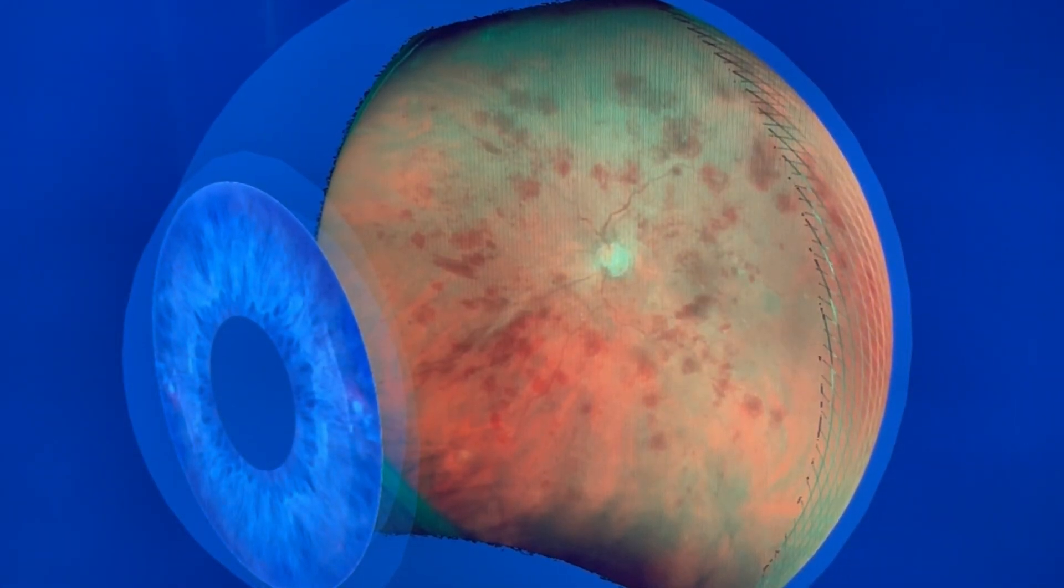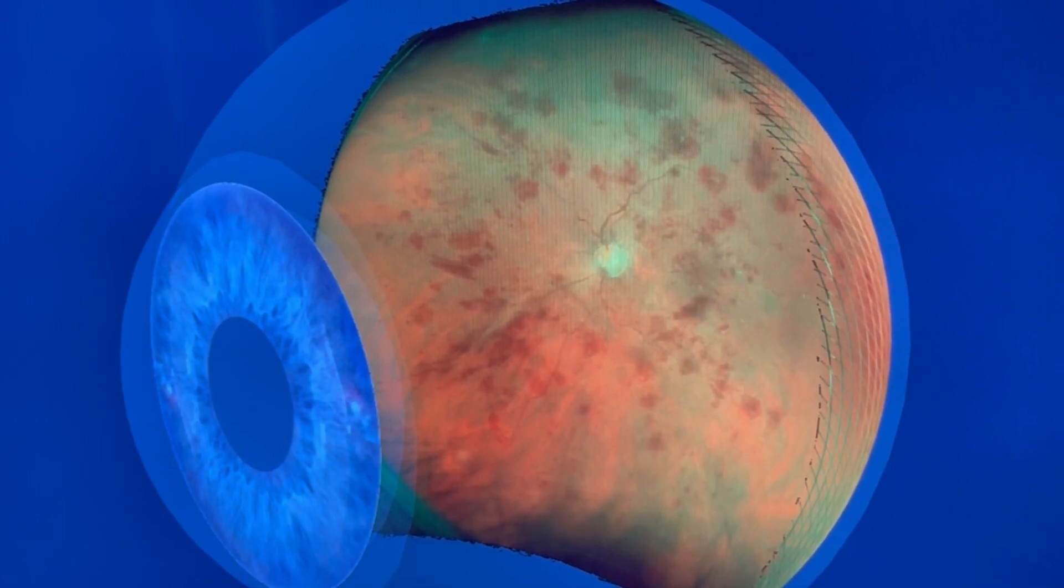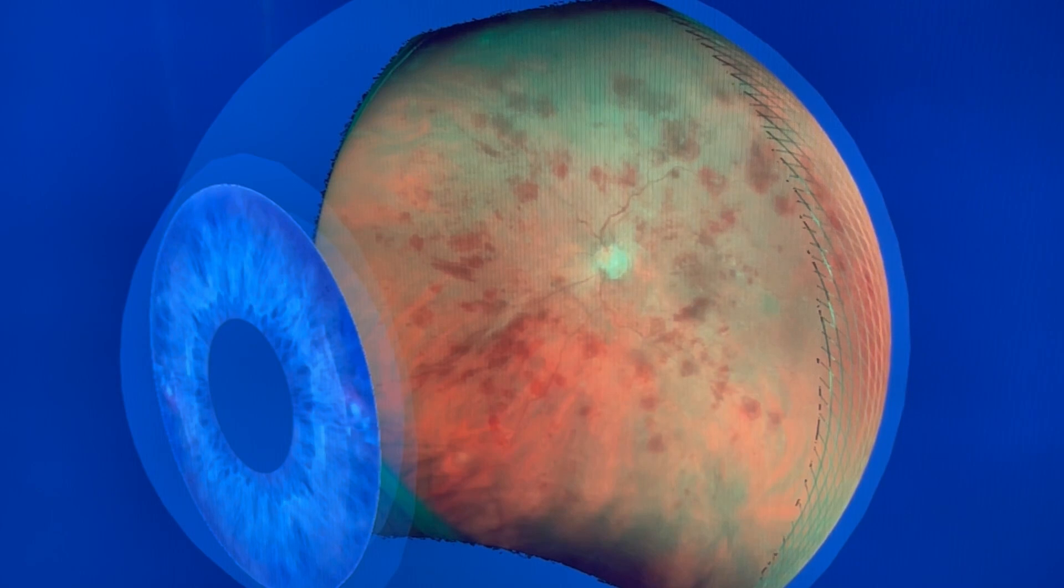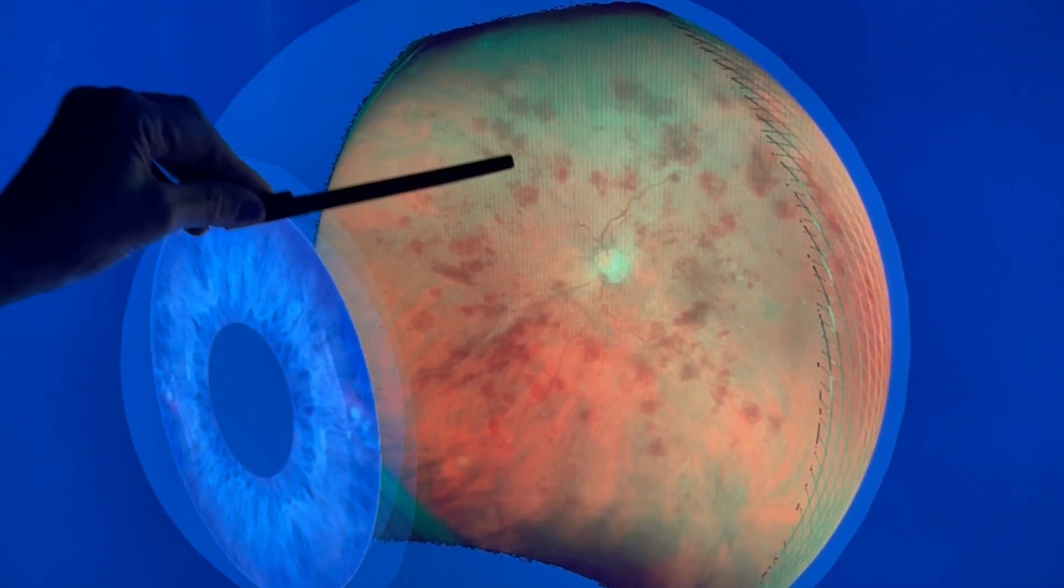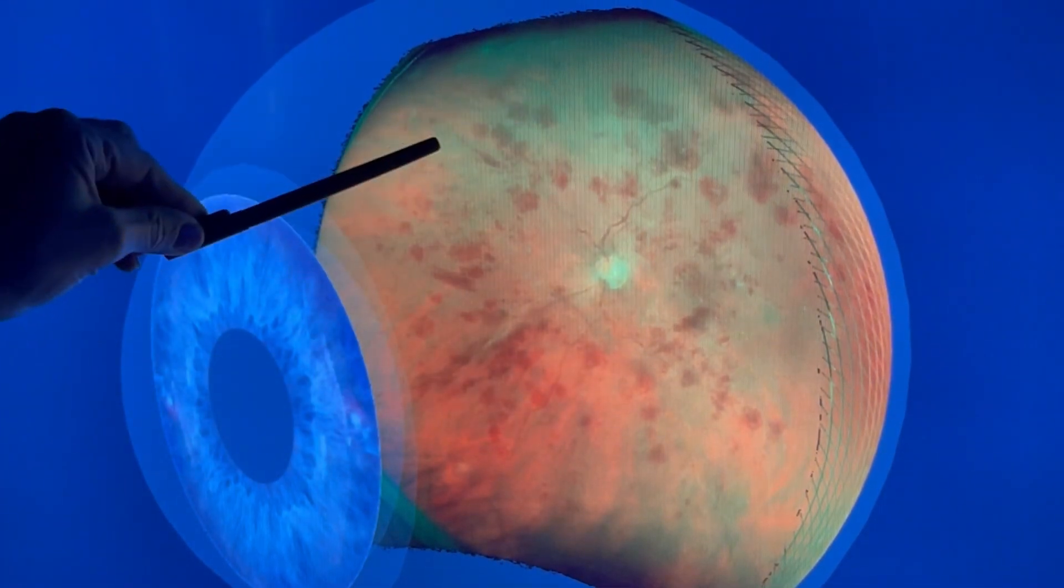Sometimes we can get a thrombus in that area which occludes the vessel, and when that happens the blood backs up into the eye as you can see here. It almost looks like someone scattered ketchup all over the retina.